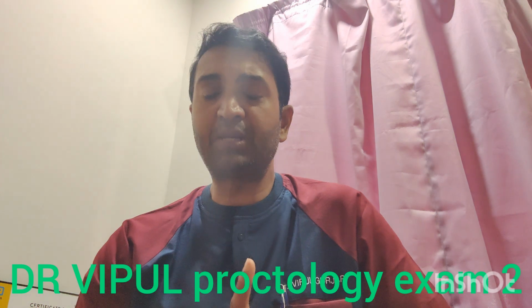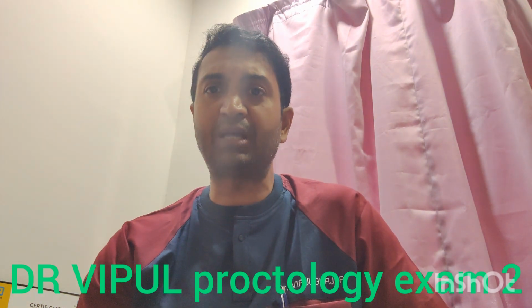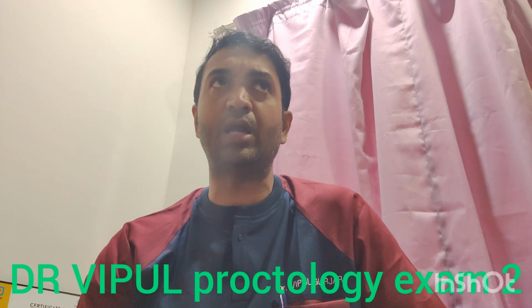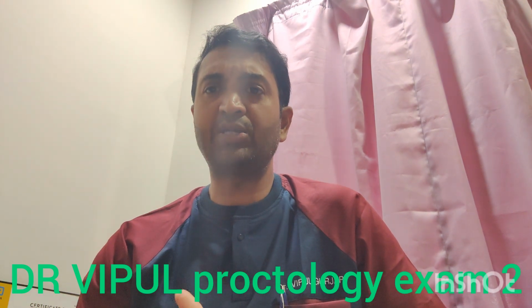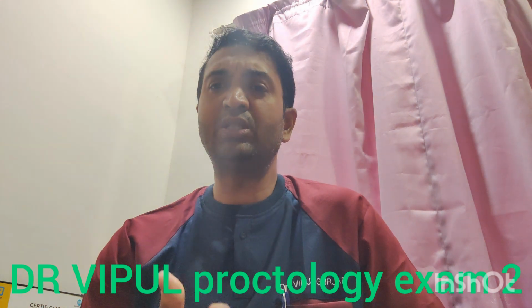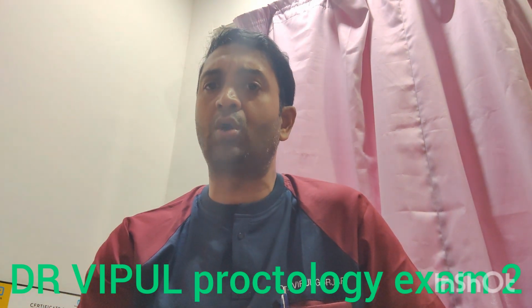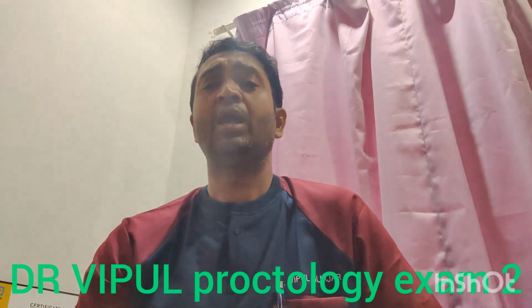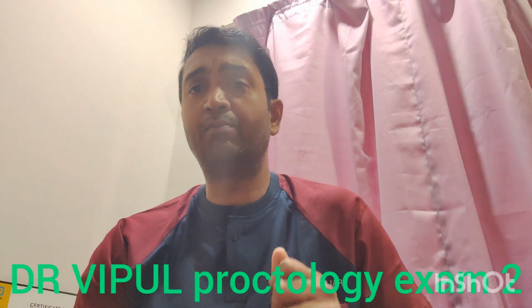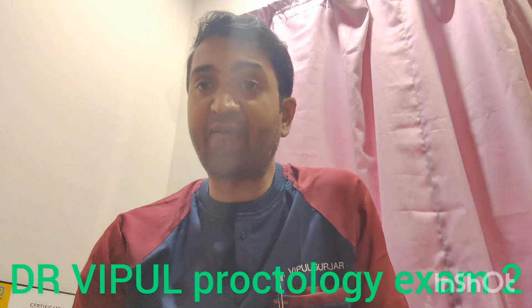First, do the PR examination. Don't do the proctoscopy examination directly. Do the PR examination with xylocaine and ask the patient to breathe out and breathe in. During every breathe out, you push the proctoscope slowly inside, and the handle must be towards the sacral cleft.